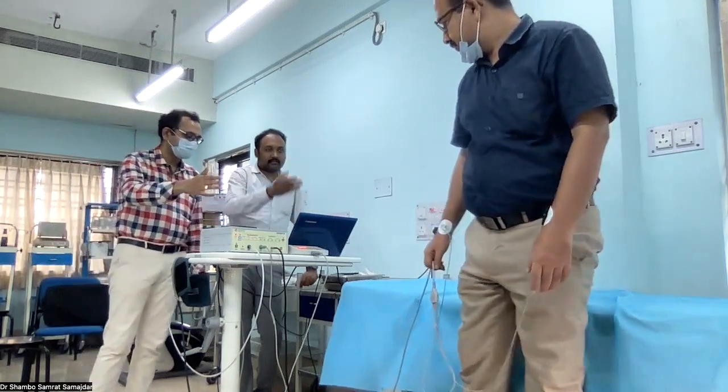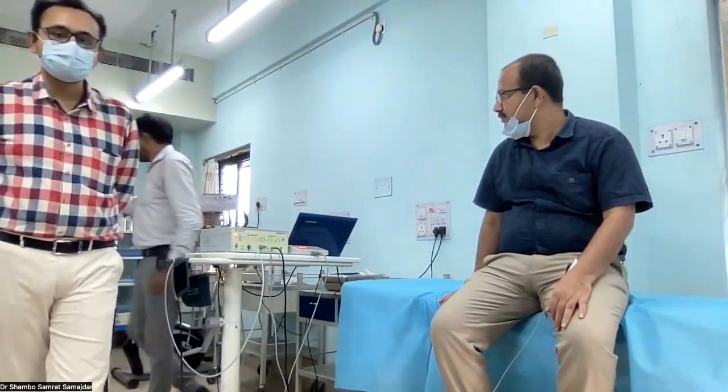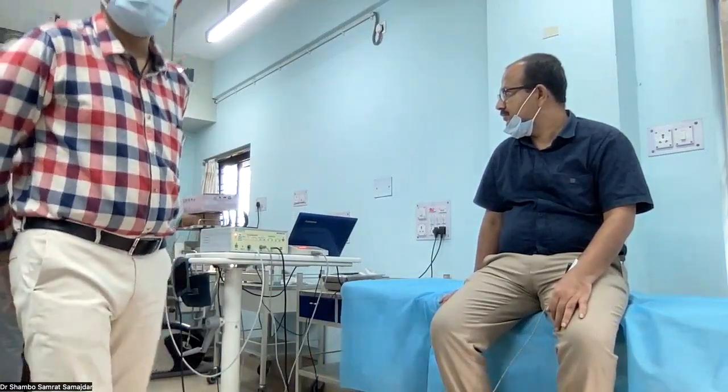Okay, so we have done it. So please be seated. Now we'll go for Valsalva maneuver. So next is the Valsalva maneuver. And for Valsalva maneuver, it is better to ask patient in the sitting position so that they can blow it properly.